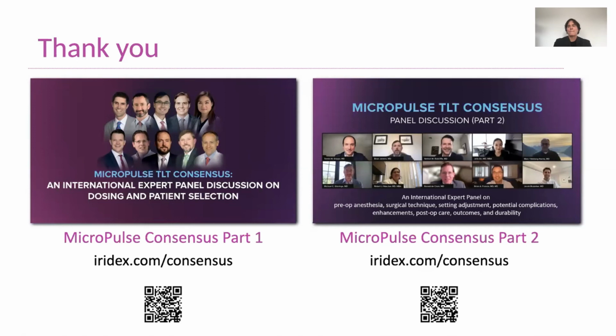Good, excellent. Mark? Well, not much to add. I think the most important thing I learned during this process over the last year was the importance of the coupling agents and the sweep velocity. If you start doing it, a sweep velocity of 20 seconds per sweep is really hard to keep because it's very, very slow, and you think you're going slow. Really keep the timer in mind. It is probably still not slow enough, but it makes a huge effect on the results. And the same as Brian just said, my happiest patients are also the patients after a tube, whether it's in the high teens, needing the low teens, and I'm more than happy to get that rather than do a big surgery again. Yeah, I agree. Jacob?